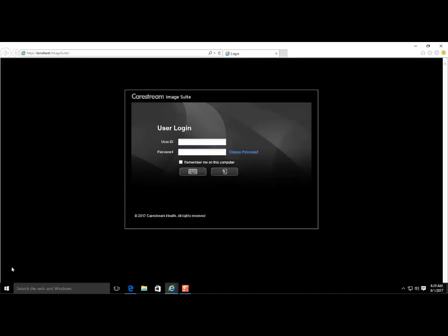Log into Webpacks with username and password, then select Enter.